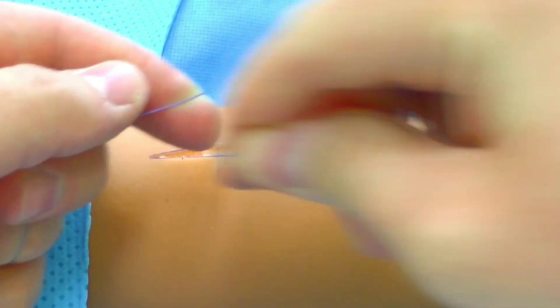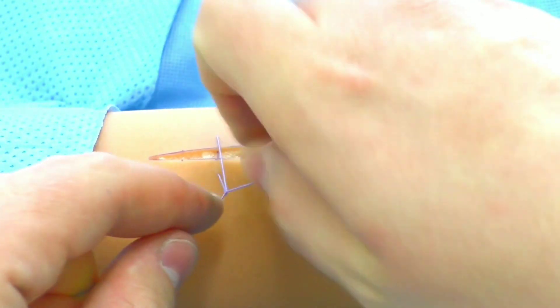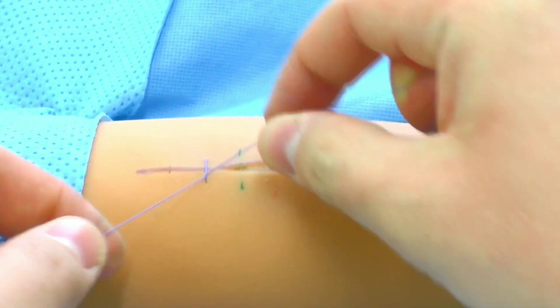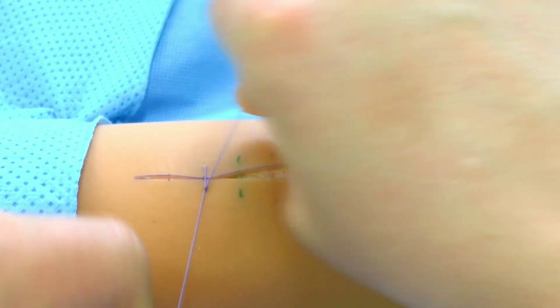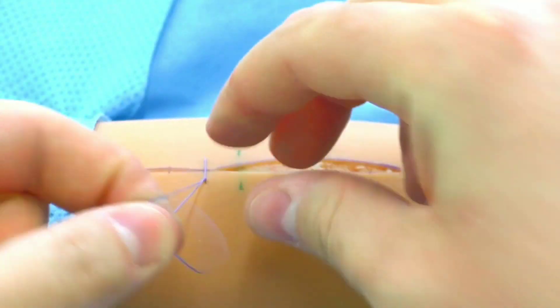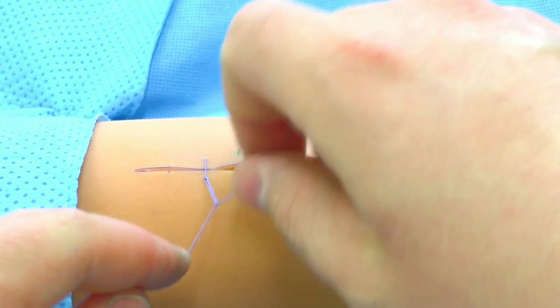The knot is then made according to the observance of the rules, and the ends of the filaments are cut off. The points of needle input and output are located at an identical distance from the wound edges, approximately five millimeters.